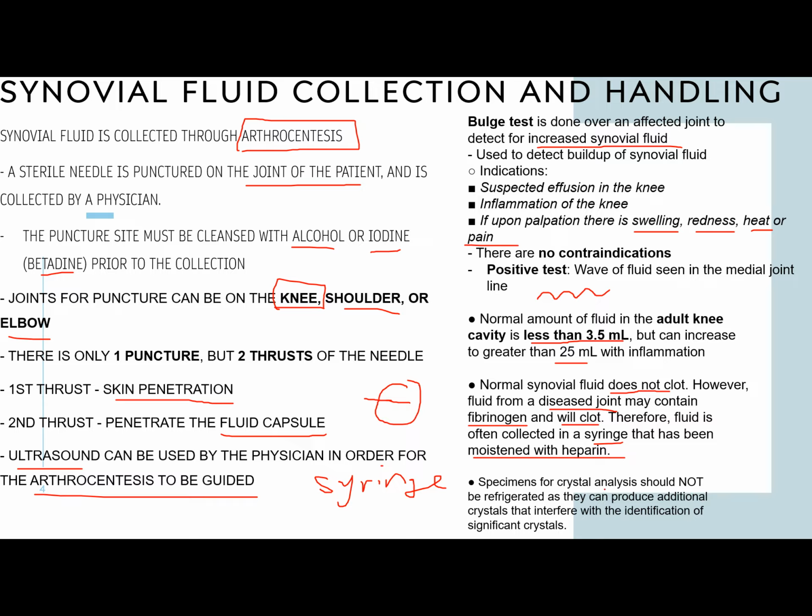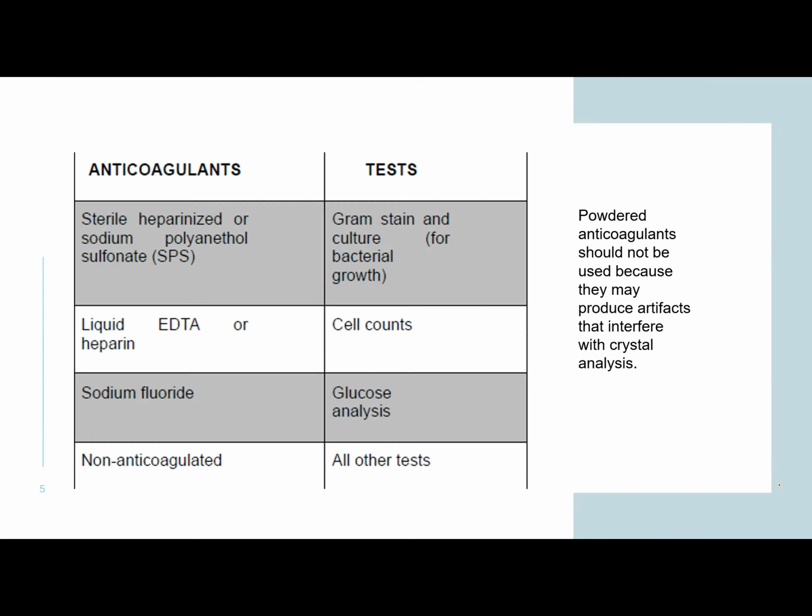Then specimen for crystal analysis should not be refrigerated, class, as they can produce additional crystals that interfere with the identification of significant crystals. So these are the different anticoagulants, class, used for different types of tests for synovial fluid.